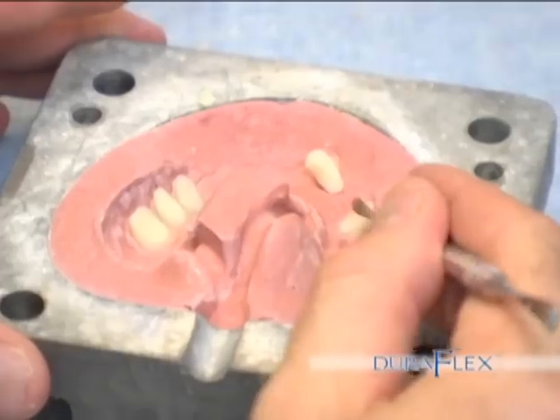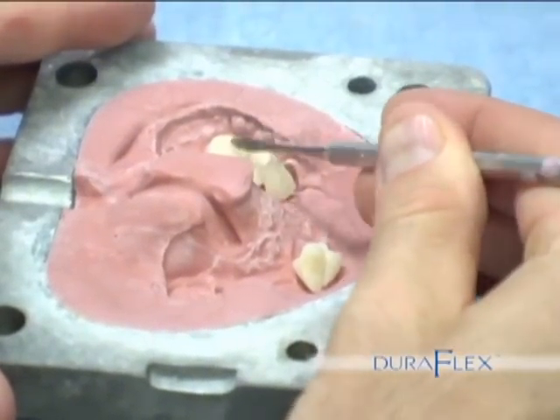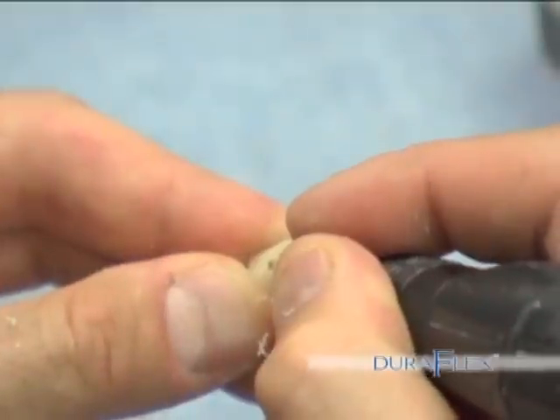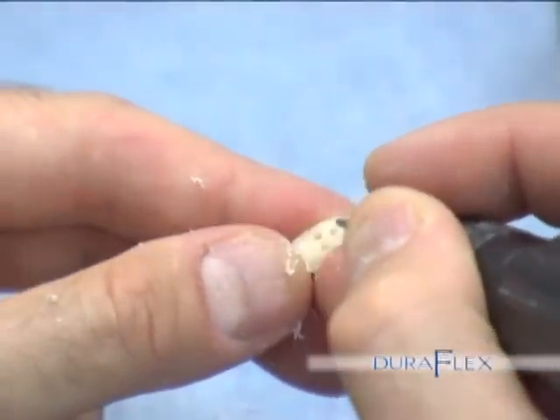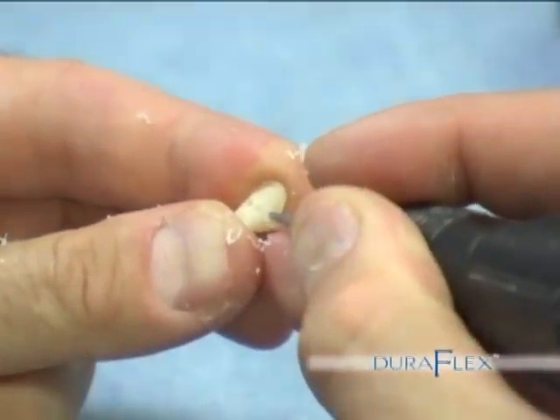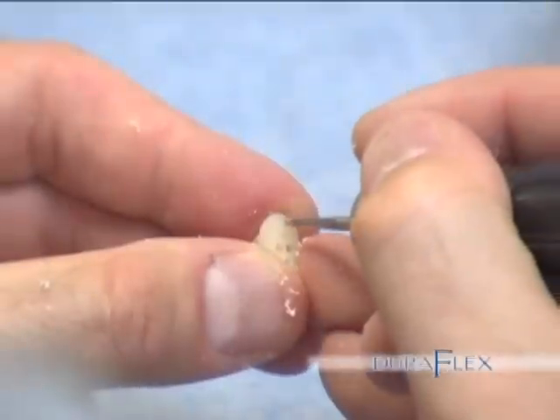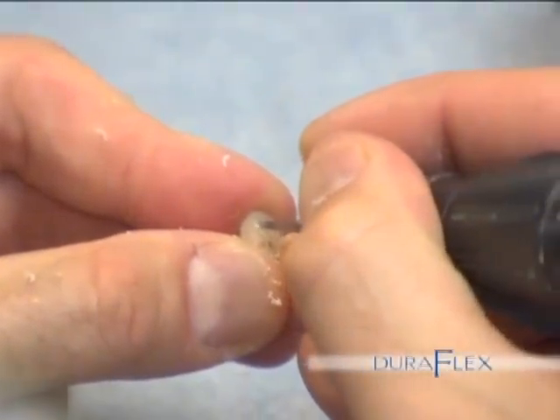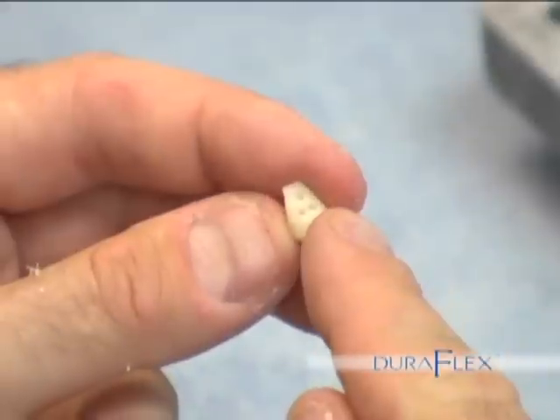Now you will need to remove the teeth from the mold so you can place retentive holes. Drill holes. There is no chemical bond between the teeth and the Duraflex base, so mechanical retention needs to be created. Drill holes in the teeth, being careful not to weaken them. Place a hole in the bottom of the tooth and then in the interproximal or lingual side. These holes will ensure the Duraflex flows properly into the teeth, forcing out any air bubbles.